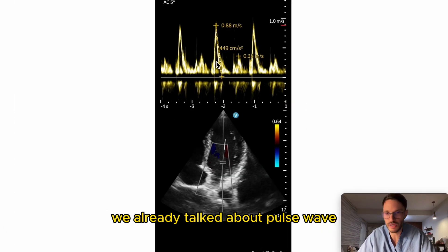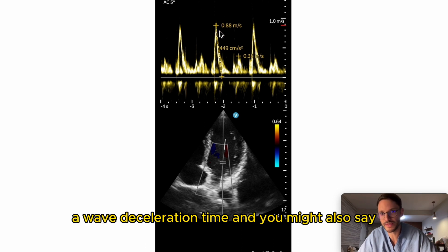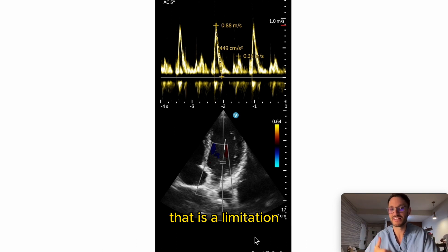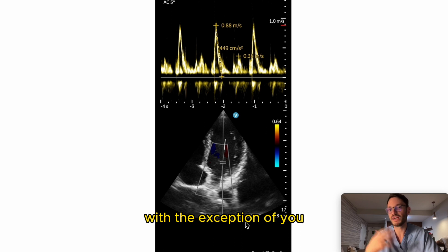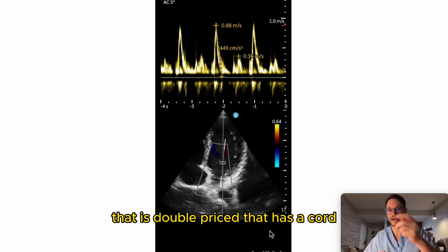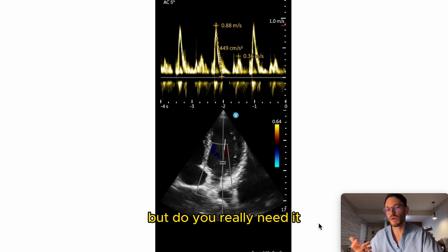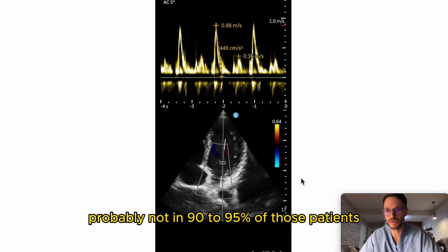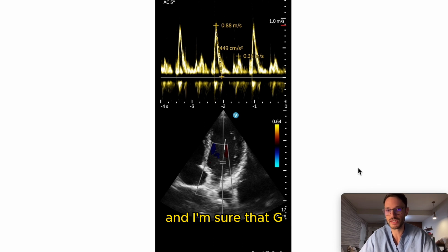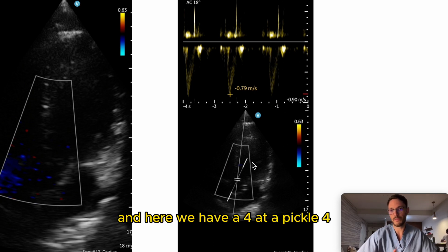Now a new addition: diastolic function. You can measure E-wave, A-wave, and deceleration time. You might ask about the electrocardiographic tracing — yes, that is a limitation with basically all handheld devices, unless you buy the double-priced version with a cord and tablet that supports EKG. But in 90–95% of patients you probably don't need the EKG tracing, and I expect GE will have this within the next five years given how quickly they're advancing.